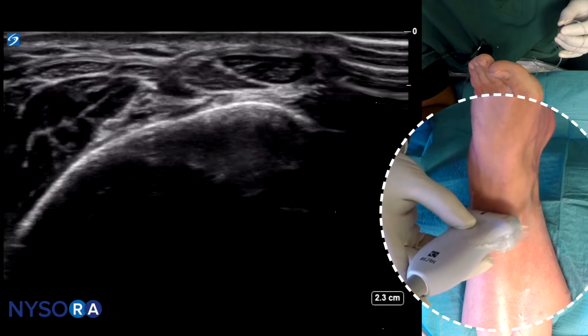For the superficial peroneal nerve, here is what we see: the lateral compartment, the anterior compartment, the fibula. And there — those are the branches of the superficial peroneal nerve. There is the main trunk as well. We want to inject into that space and achieve the block of the superficial peroneal nerve.